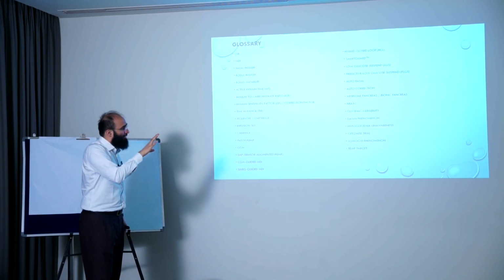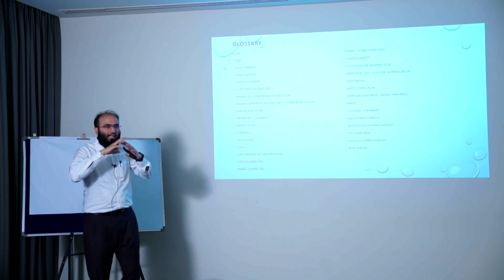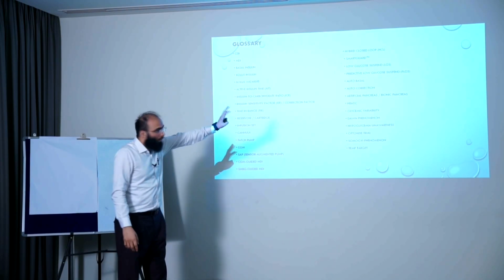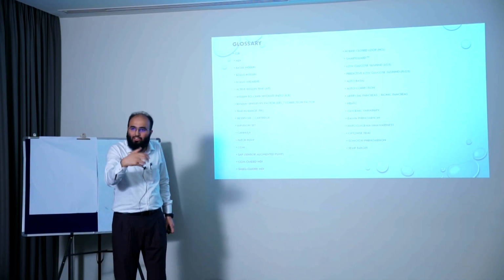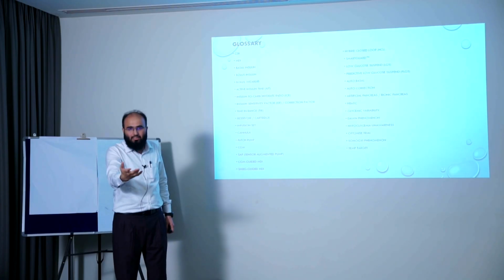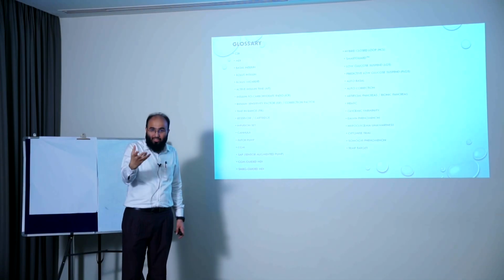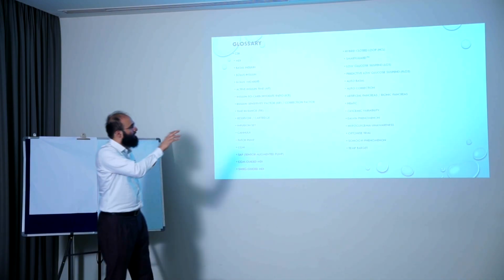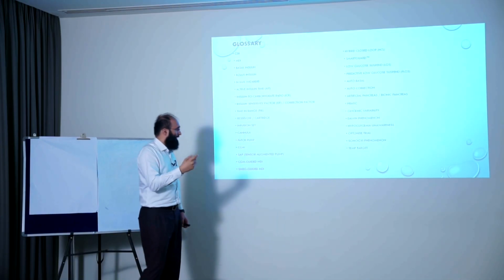Artificial pancreas or bionic pancreas, this is something that we would ideally want. A complete artificial pancreas system for a patient with maybe type 1 diabetes. So this bionic pancreas is this pump plus the alpha cell action also. The glucagon is also released, not just insulin. Insulin is from the beta cells. Alpha gives you glucagon. So if the pump is able to give glucagon and insulin as needed, then that is a bionic pancreas.